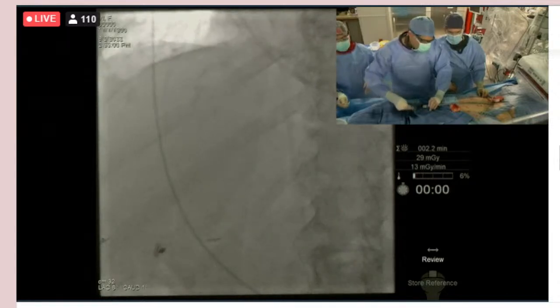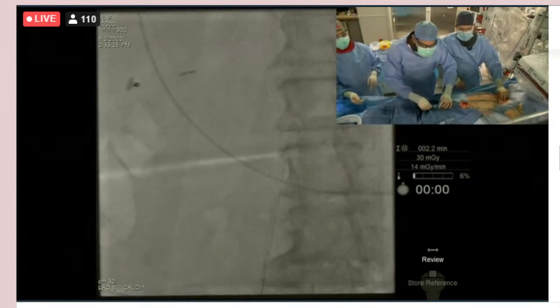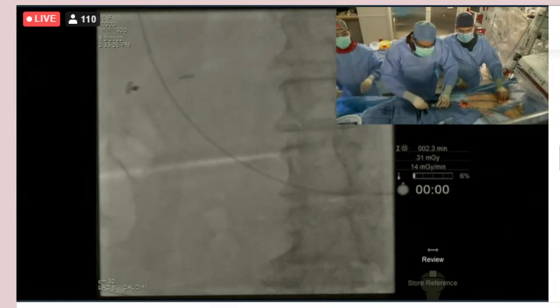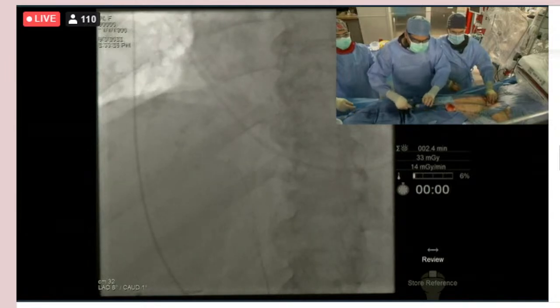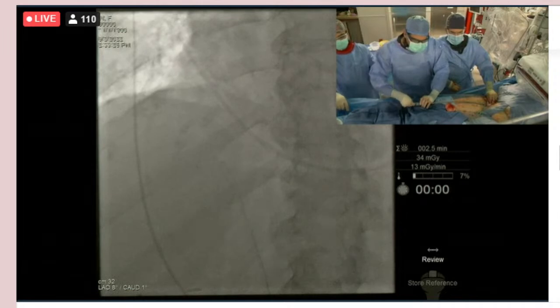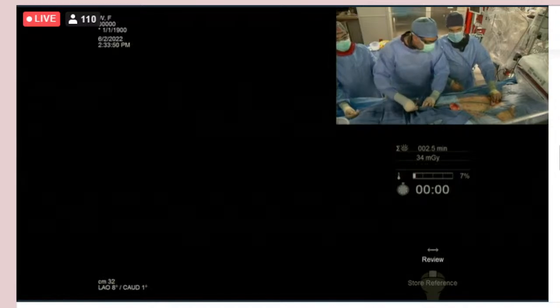Or I use the pre-close and post-close. Yeah, we've done it both ways, with figure of 8 and with pre-close, and it seems to work well either way. But you do have to make a big skin nick, and so I always wonder how those seem to heal okay. It is amazing you don't get more vascular complications when you see the size of that sheath. But we've really done very well with just a figure of 8. We don't use pre-close at all, and most patients do extremely well and are ambulatory in 4 hours.